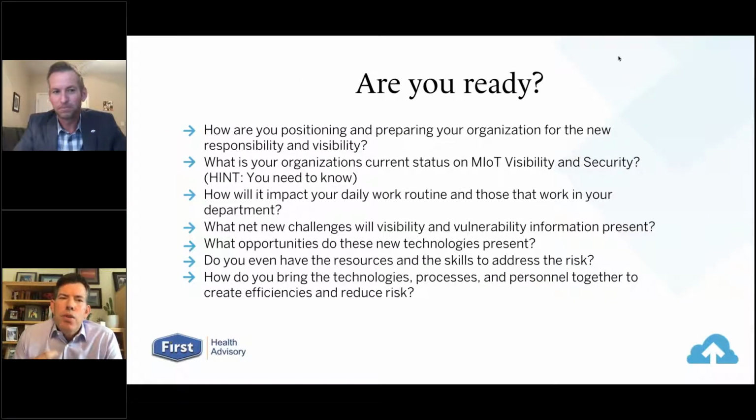I also want to add, in HTM, you've always had accountability for this fleet of devices, yet the responsibility of mitigating cyber risk specific to these assets in many organizations has become a hot potato. It's causing some turbulence, to say the least. And whether you report up through IT or separately through supply chain or even a different department, HTM has never really had the tools to address cyber-related risk beyond perhaps vendor-provided guidance or documents like the TIR 57.